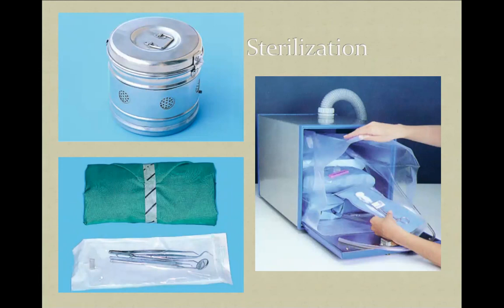Well, again, I will not talk about preoperative preparations because preoperative preparations are the same. Usually we're using IV sedation, we're using local anesthesia. Now, the difference of the local anesthesia once you're doing dental implant placement is that you are not using blocks at all. You see, once the bone loses the tooth, there's no nerve endings inside the bone. So your local anesthesia's aim is to anesthetize mucosa and periosteum only. You should not anesthetize the bone.